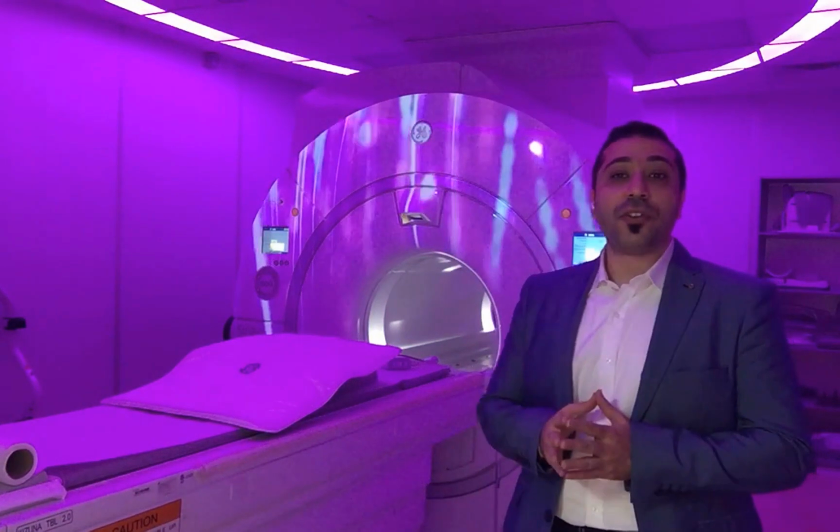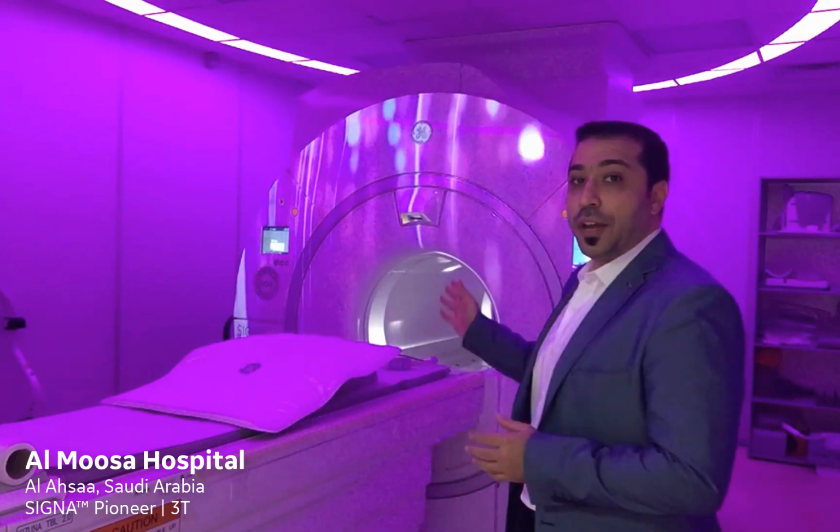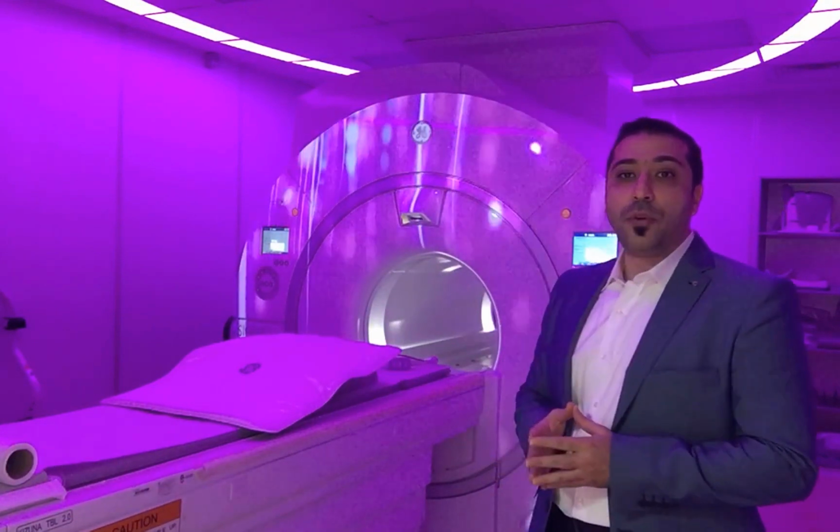Hello, and welcome to our session. This is Talib Kubaisi, the MRI clinical leader at GE Healthcare. Today, we will scan together an interesting advanced topic about the cardiac 4D flow. And I am in one of our show sites in Saudi Arabia at Al Musa Hospital. We will be scanning on our 3T system, Signa Pioneer, using the air coil.